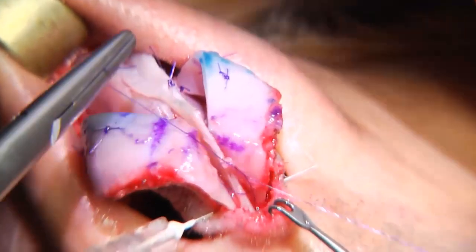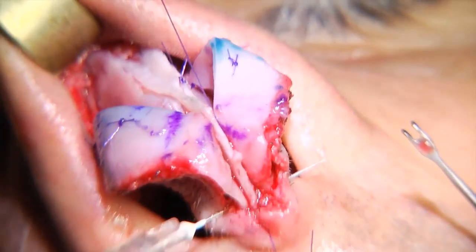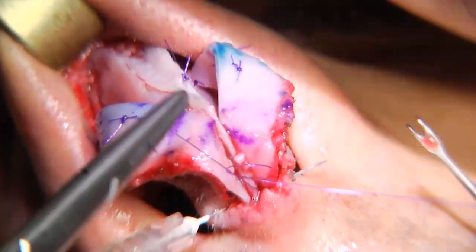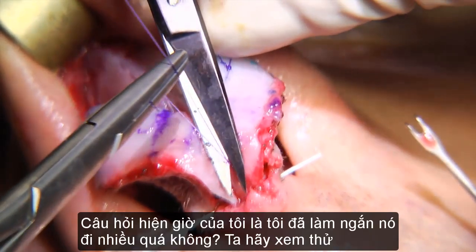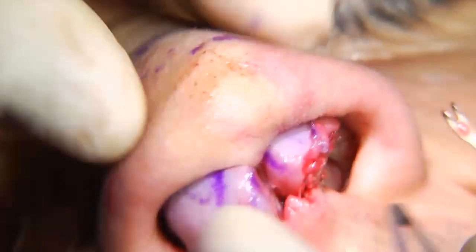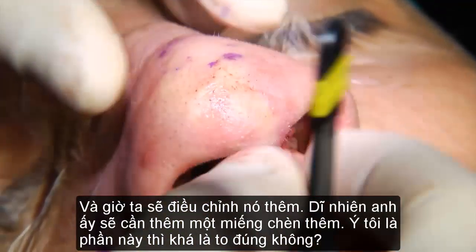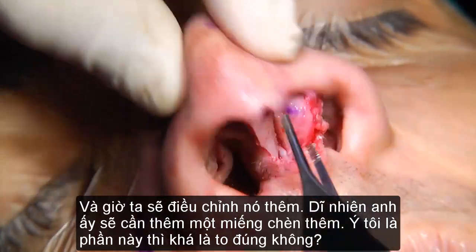So I started with some overlapping of these. Now my question is, did I shorten it too much? Let's have a look. No, it's correct. Of course he will need wedges. I mean, this thing is massive, right?